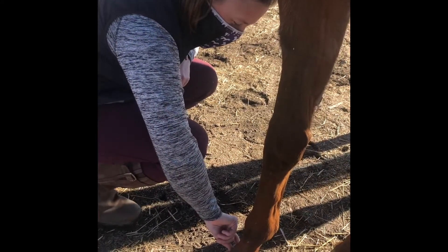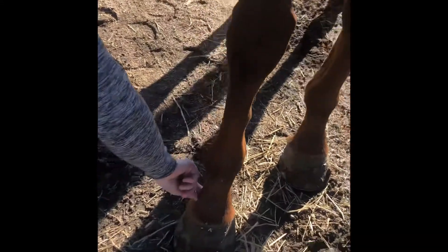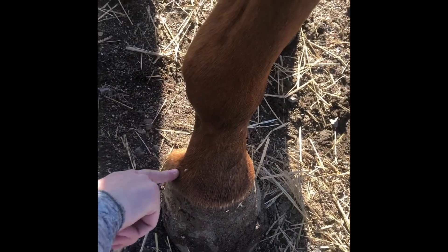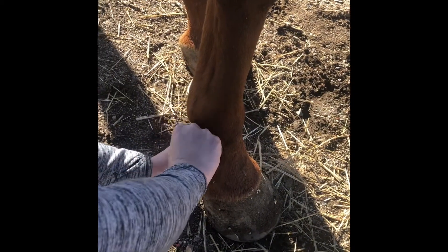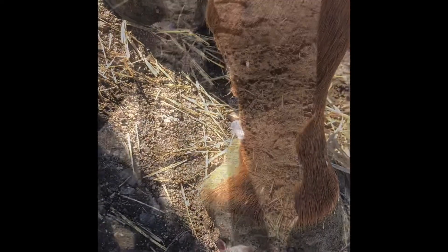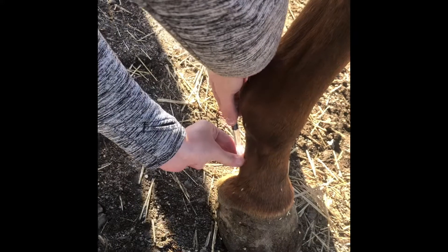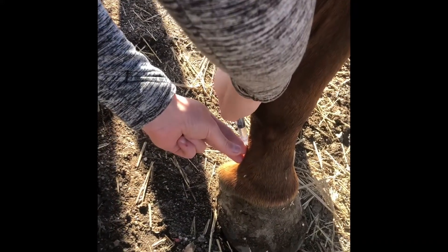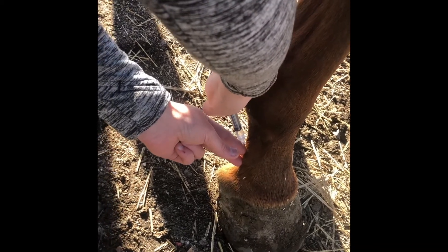So first we're gonna do the palmar digital nerve block. I can feel the nerve passing under my finger right here above the lateral cartilage of the foot. First I'm gonna place the needle into the skin, then we will inject the carbocaine under the skin over the nerve. Usually one to two mils is enough.